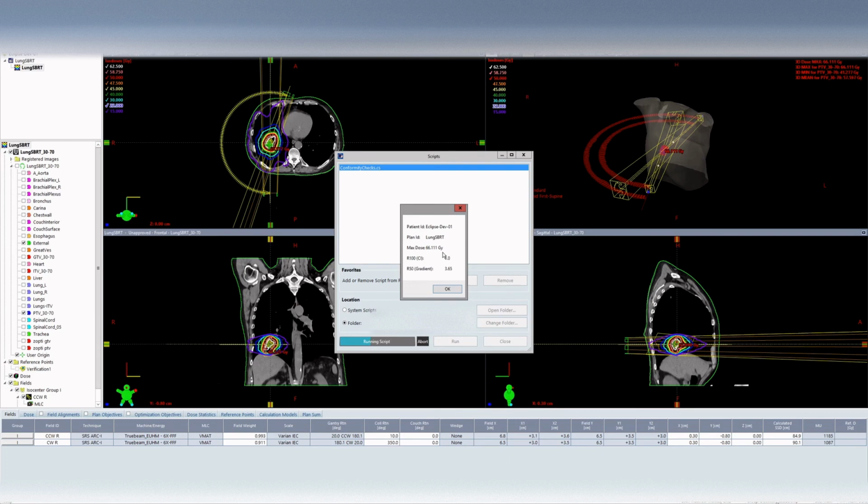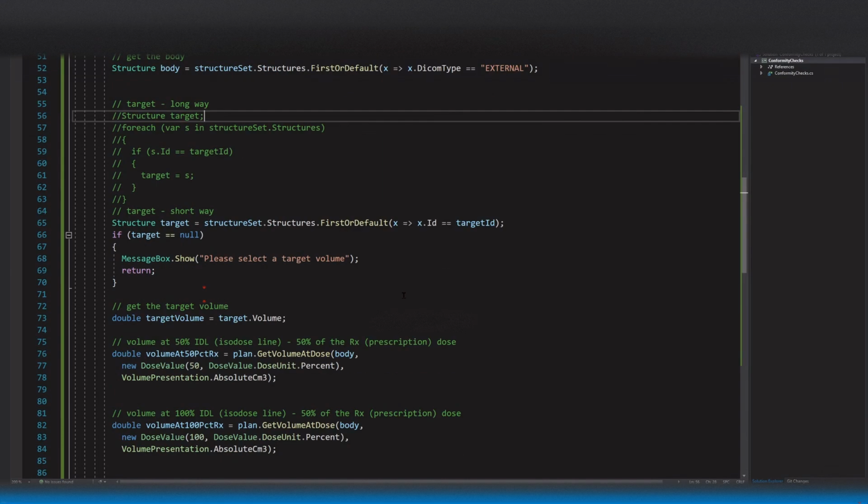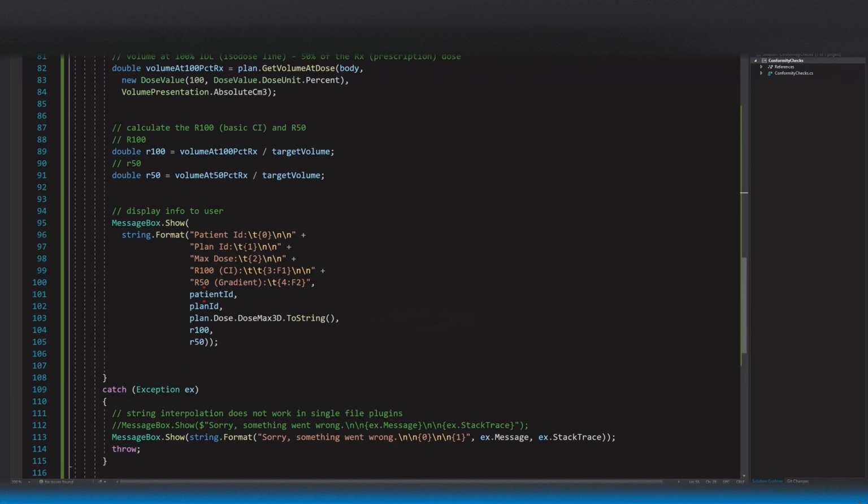If you want it in gray, you can explicitly say that you want the plan's dose value presentation to be in absolute dose. Okay. And this is kind of silly at this point, but this is kind of what happens. You start figuring out some formatting just to make it look pretty.